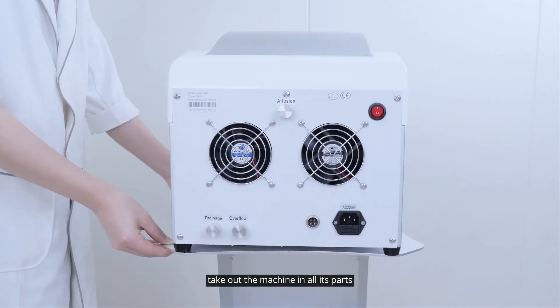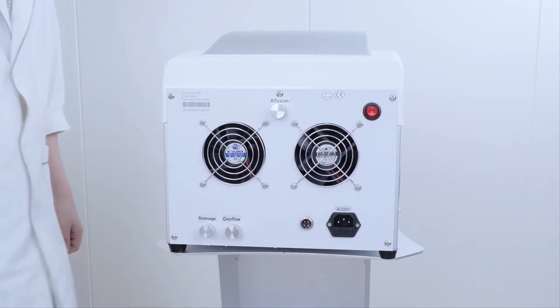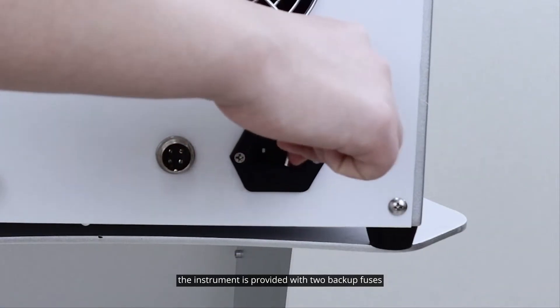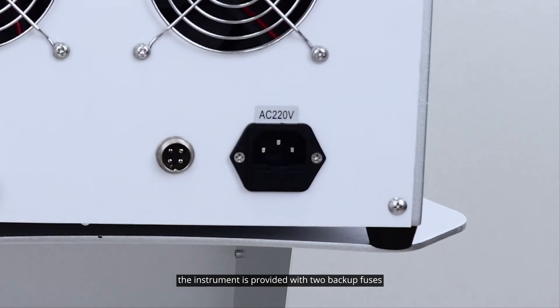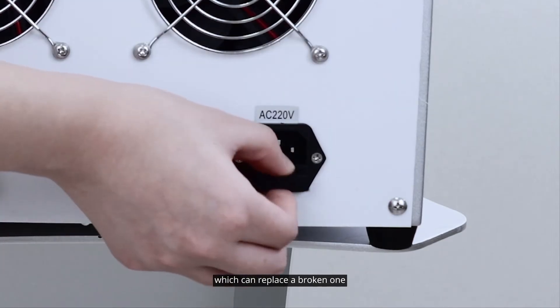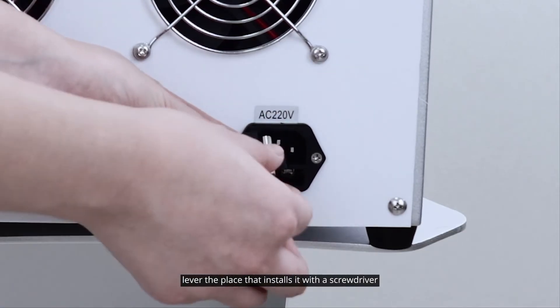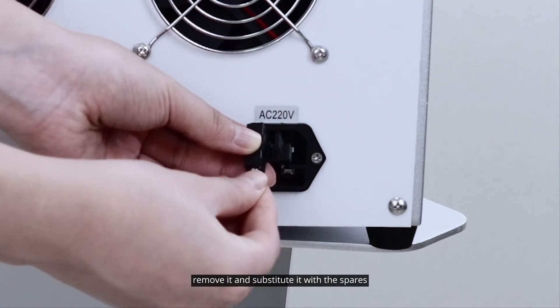Take out the machine and all its parts. The instrument is provided with two backup fuses, which can replace a broken one. If the fuse is damaged, slowly lever the place that installs it with a screwdriver, remove it and substitute it with the spares.